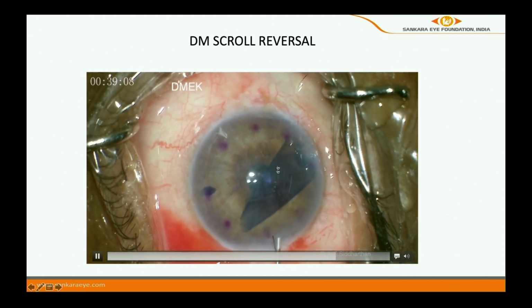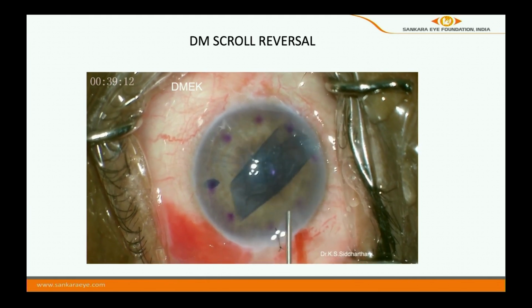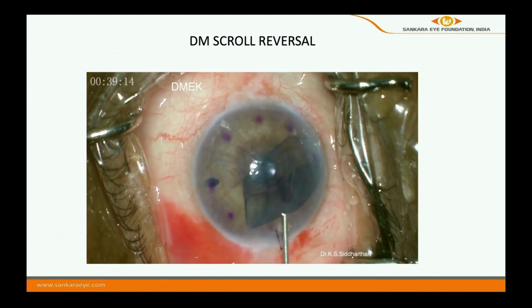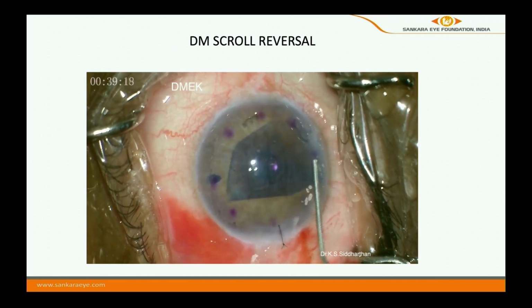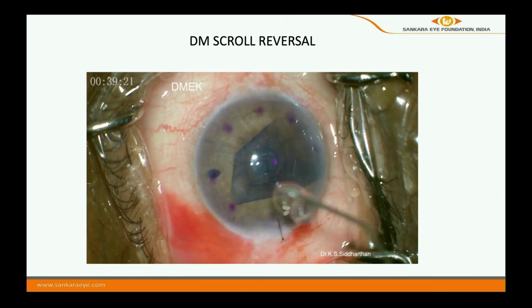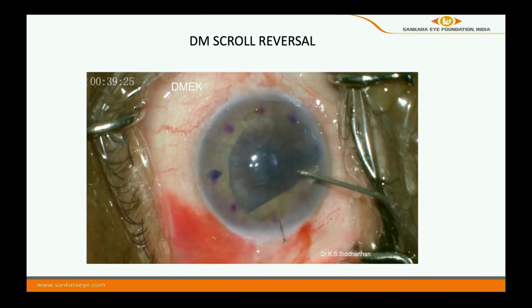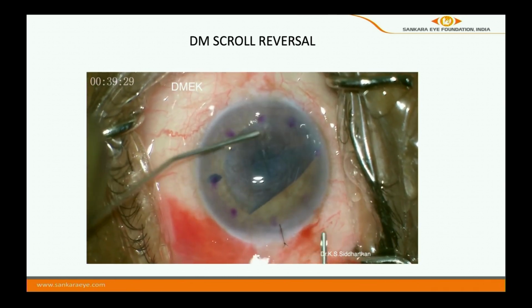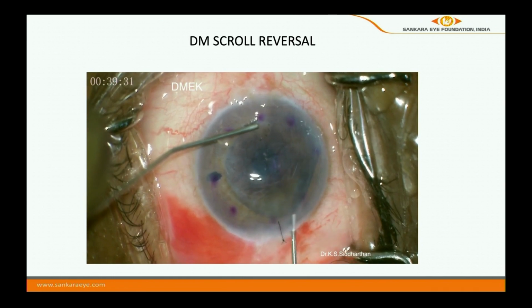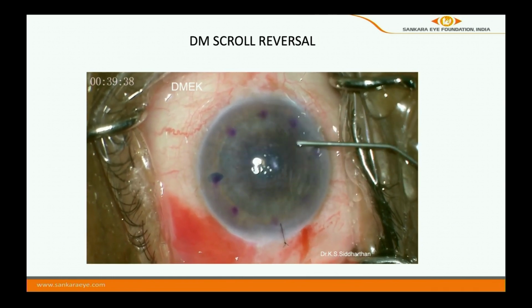So do not do anything without knowing. You have to see that the inner flap folds, and then once it folds, you can hold with your left hand and you can unfold it. So very simple, just position it. For the positioning, you need gentle taps. Once it comes to a position, just hold it, inject saline, release, and that's it. So it's not going to be very difficult.